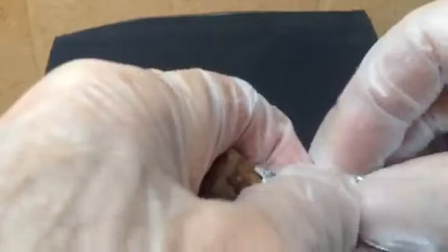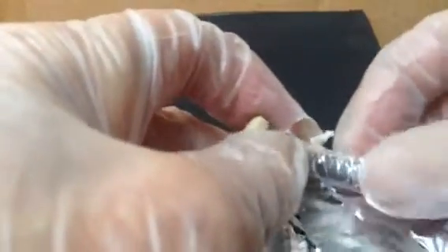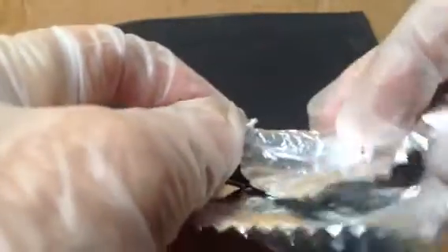One big advantage of the foil over a layer of plastic film is it distributes the heat. There's a lot of heat generated with super glue and cellulose. The aluminum serves to cool it down, and by putting pressure through it, it shapes the final repair.